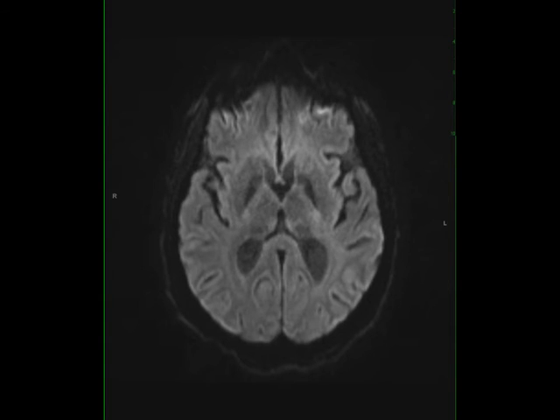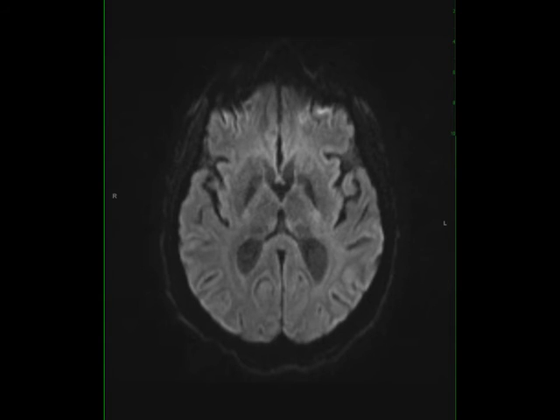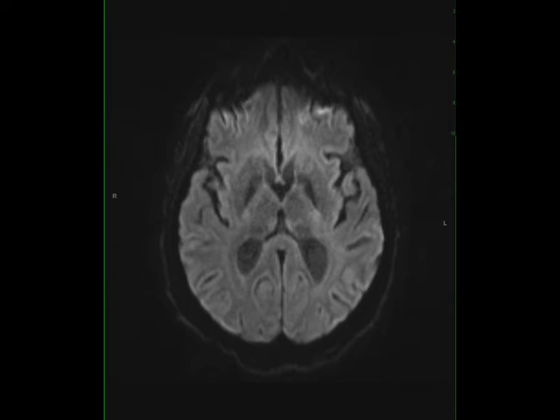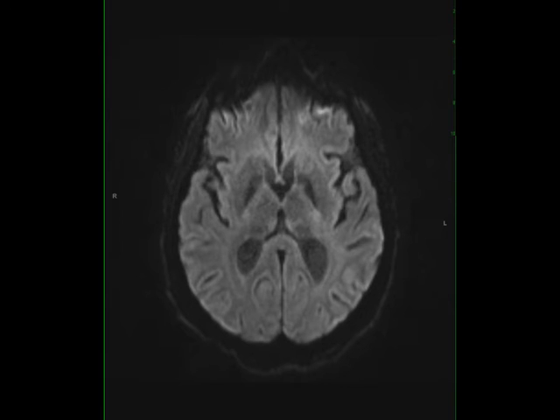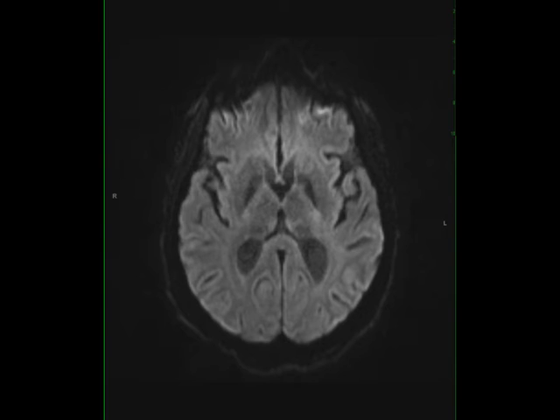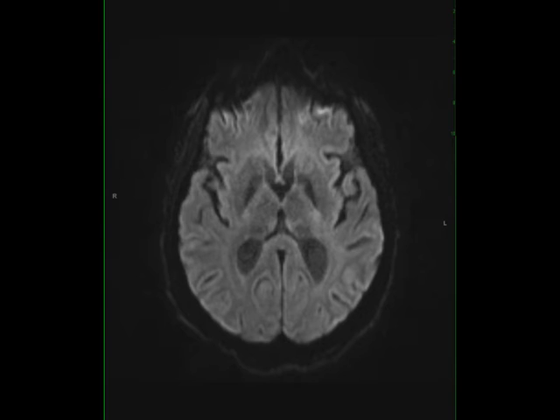There are no suspicious abnormalities on the diffusion-weighted images, and post-contrast sequences demonstrate ill-defined enhancement along the perivascular spaces, worse in the bilateral frontal regions.